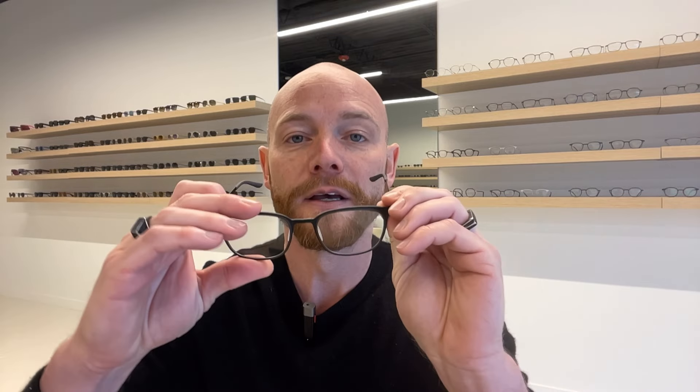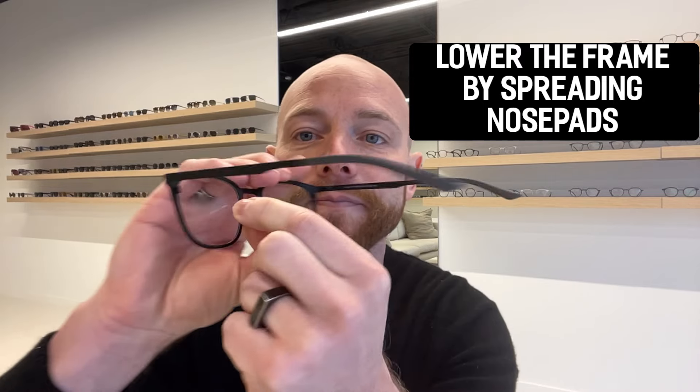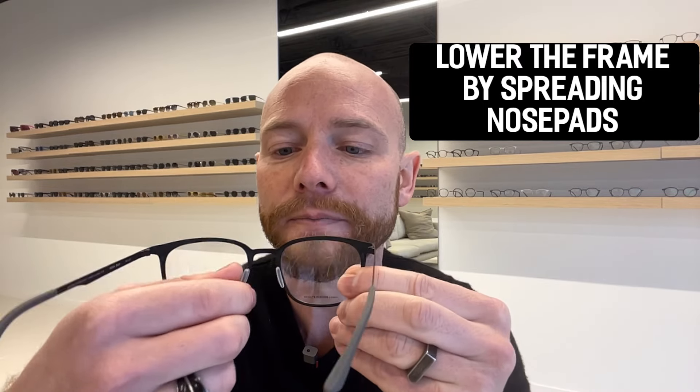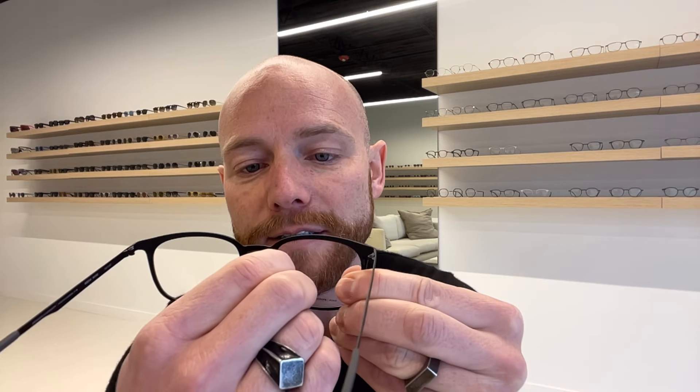The first adjustment I want to show you is how to lower the frame on your face. You're going to spread the nose pads apart — carefully controlling that push — and that's actually going to lower the frame. By widening those nose pads, it sits lower on your face.